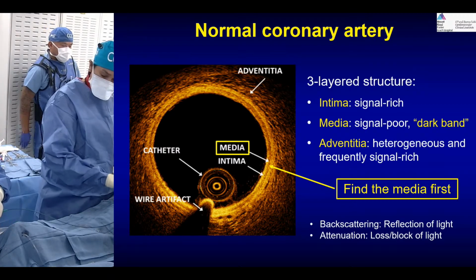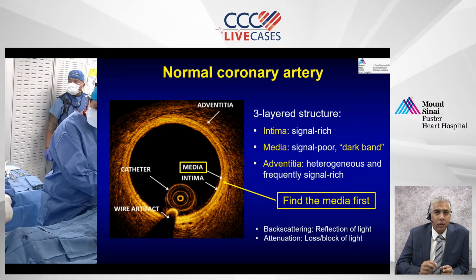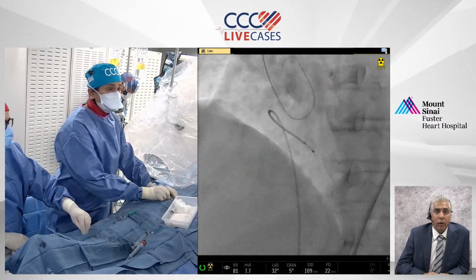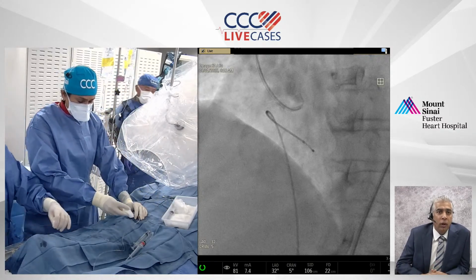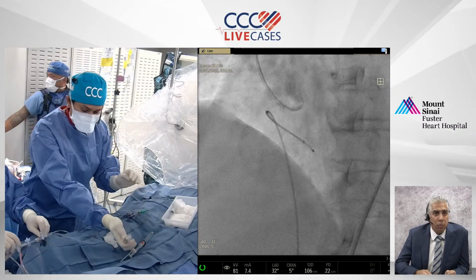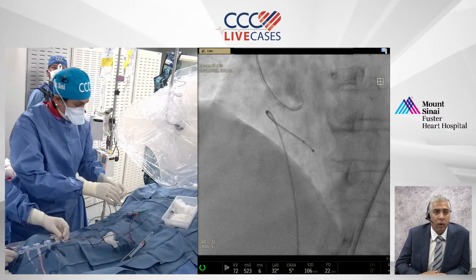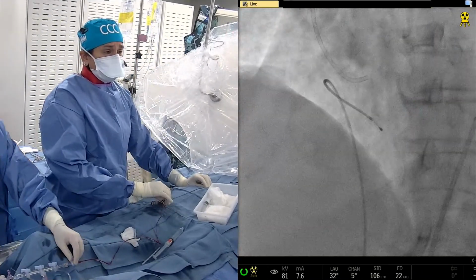That was a fantastic walk through the setup and execution. I might add one point about the guide position, not just the guide choice. It's tied to the efficacy, as you explained, but also the safety. So the ramping of the injection so that the guide doesn't disengage with injection is critical. And a lot of times we'll deep seat the guide for the injection and then be prepared to immediately back it out. So there's a lot of active participation with the guide, I would say, more so than with IVUS. Agree. So now we change the guide.